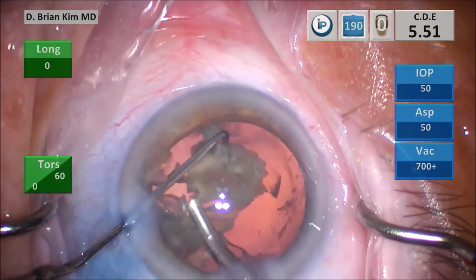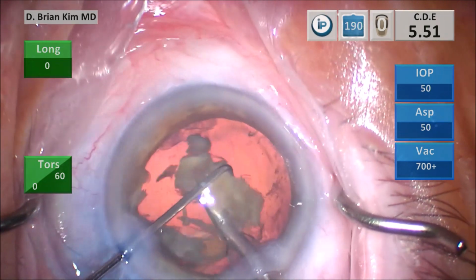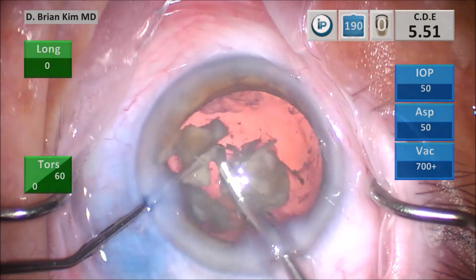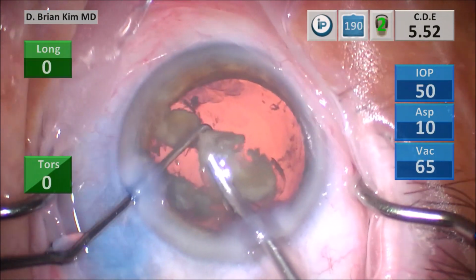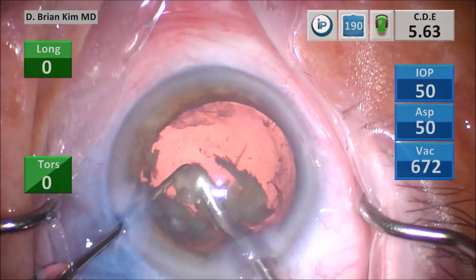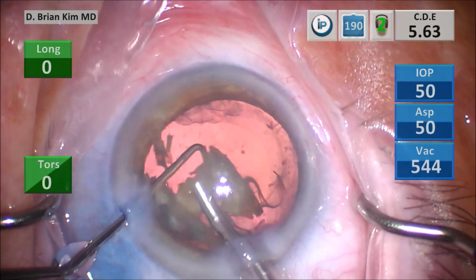And once the pieces are small enough, again, I make sure the chopper is deep and I start to emulsify the lens pieces. And I really use a lot of foot pedal modulation when I'm phacoing these pieces.